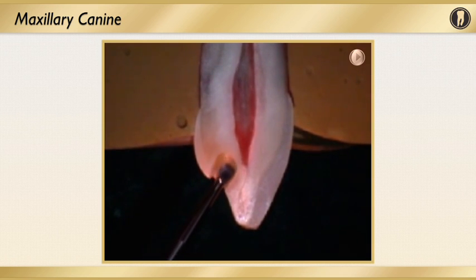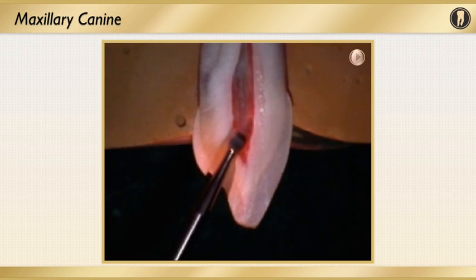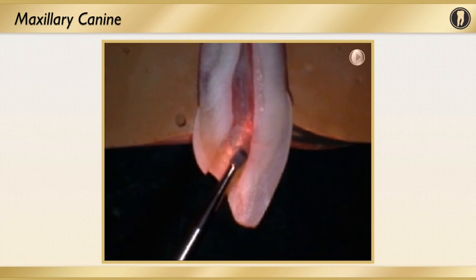Again, taking this number 2 diamond, being very careful, taking small bites, taking their time. You want to take your time. This is your penetration phase. This is the slight, gentle enlargement phase. And now you're going to go to the refinement.